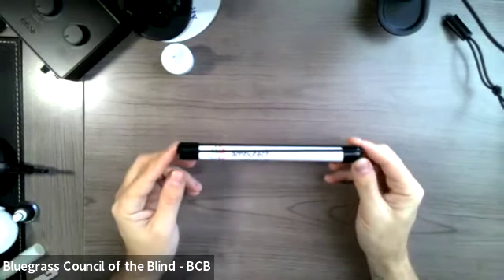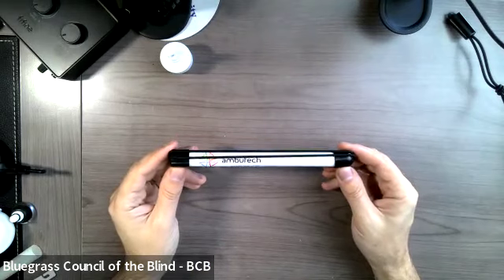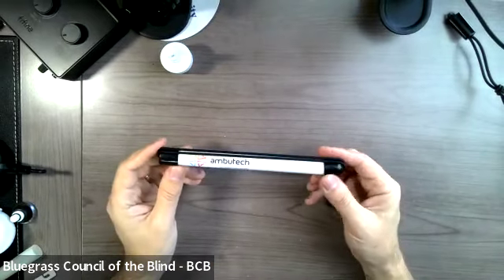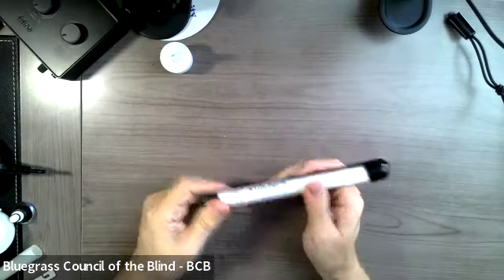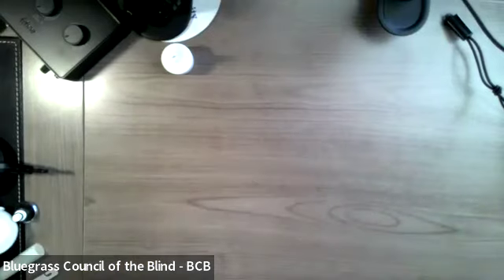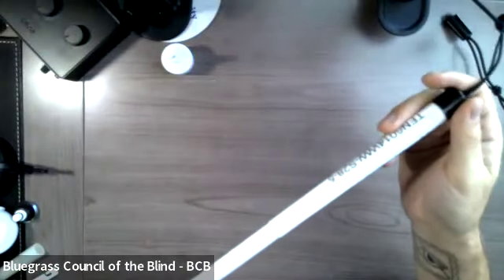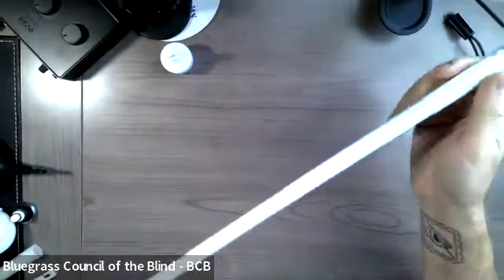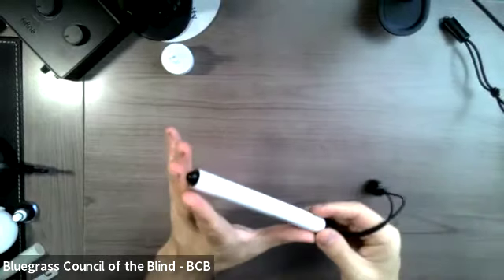Something else, I talked about the identification canes, and one thing I wanted to mention is that identification canes, especially, are more popular in European countries rather than here in the US. Sometimes they're just a cane that you just hold. It's not even long enough to go down to the ground. And this is one of those. This is a telescopic ID cane. So it slides out, and it's going to be hard to show you guys, but it's only about 28 inches long. And it's just a simple white cane, has a very nondescript, blunt tip here, and it telescopes down to a really small, maybe 6 or 7 inch container.